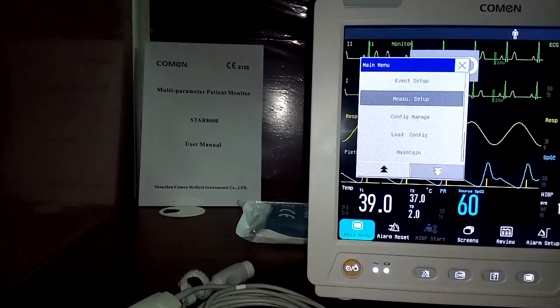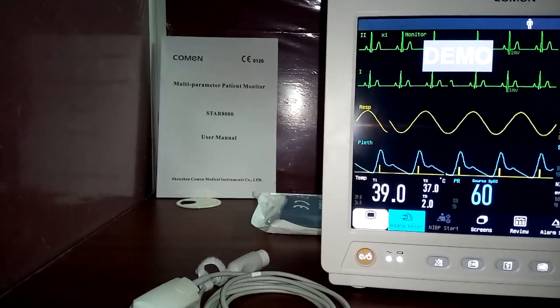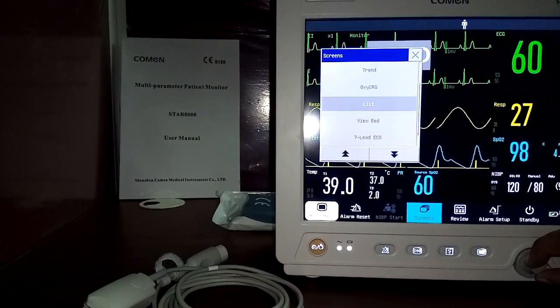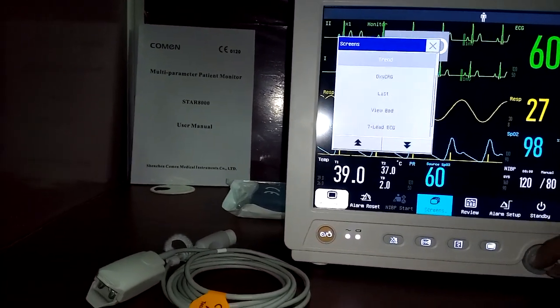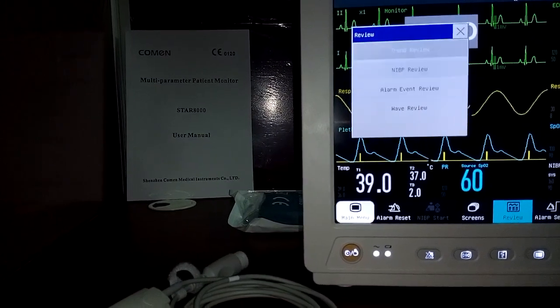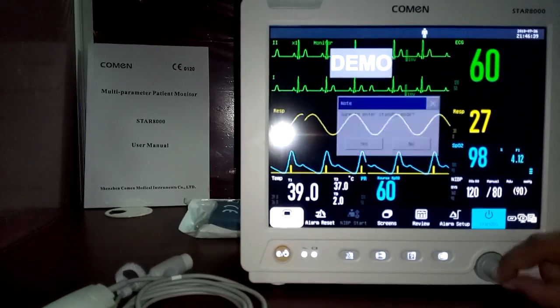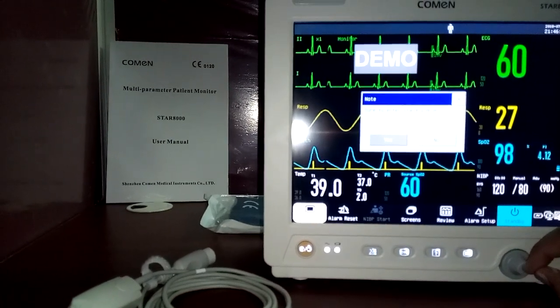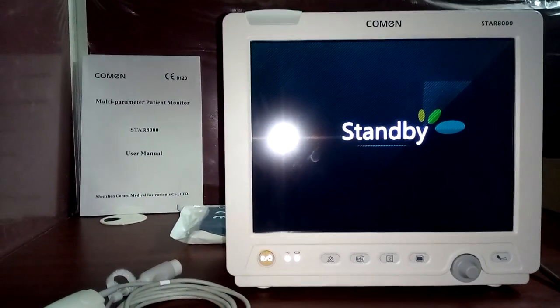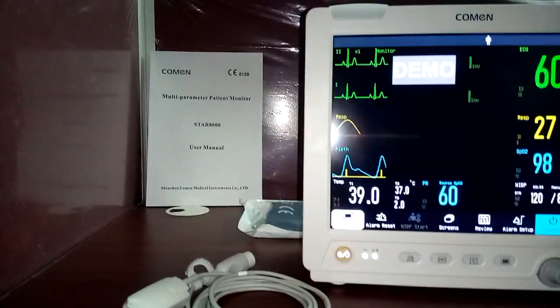From the quick-access bottom menu, you can reset all alarms, change screen formats (big font, trend, OxyCRG, list, face view, bed view, ECG), and access review. Alarm setup is also accessible here. Standby mode is available — in standby, the monitor will not generate alarms, for example when the patient goes for CT or MRI. Press 'continue' when the patient returns.